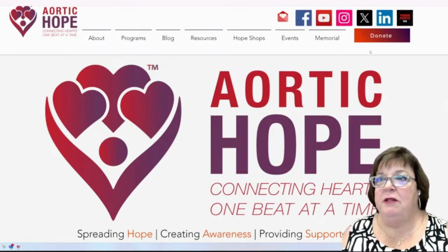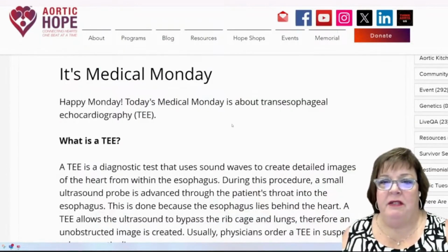So let's get started. Monday, of course, is our Medical Monday. It's Medical Monday. Happy Monday. Today's Medical Monday is about transesophageal echocardiography, TEE.